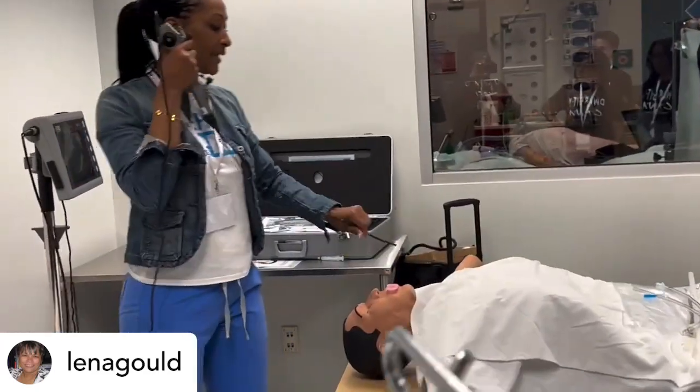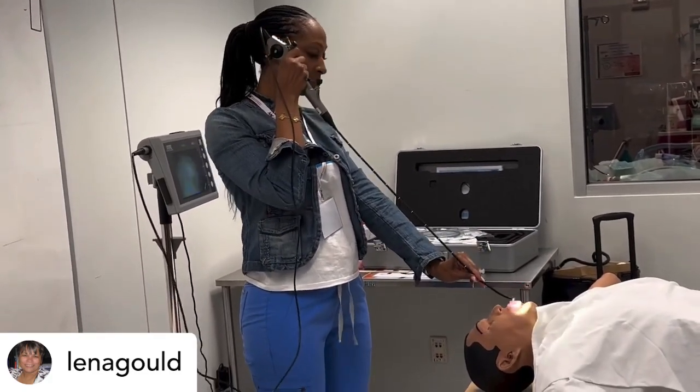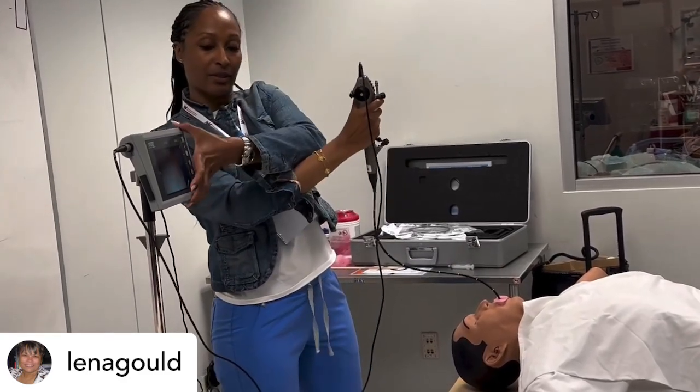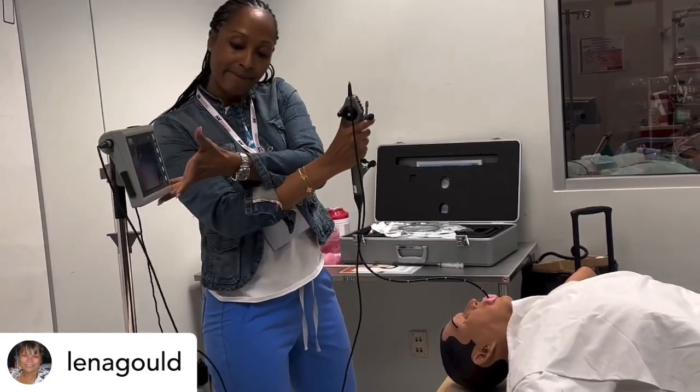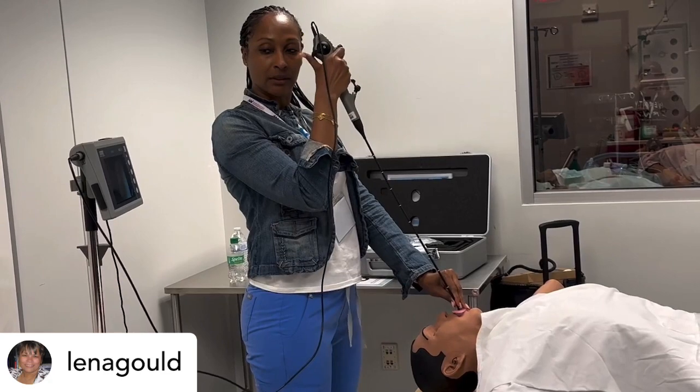So remember my mechanics. I look at my orientation first, make sure I'm up and down. I go in, and then I'm going to counter a little bit so I can see a little bit. Look at the anatomy that I'm going in.